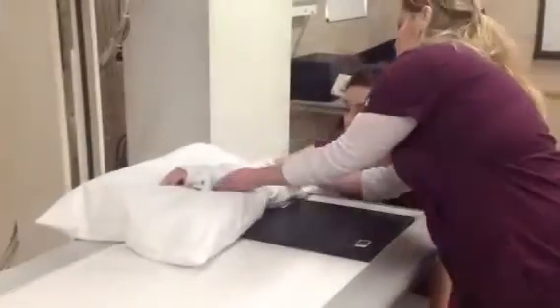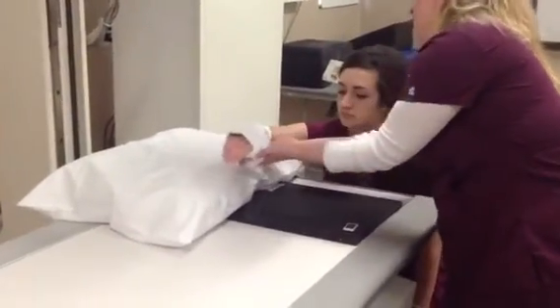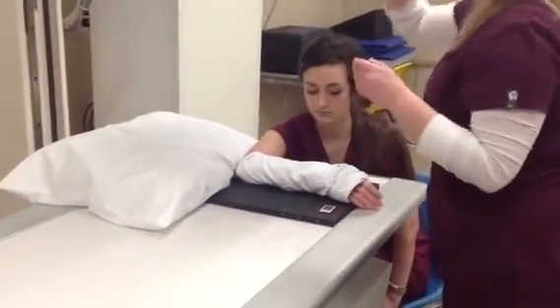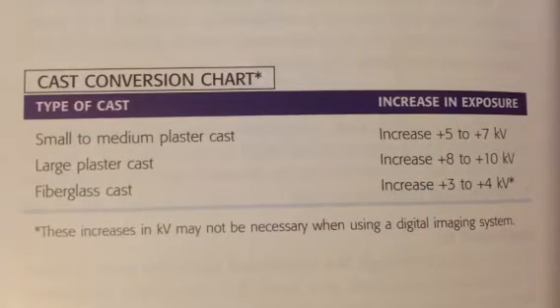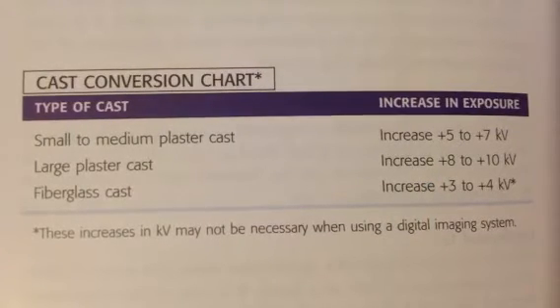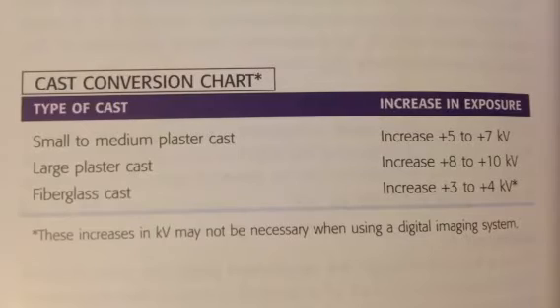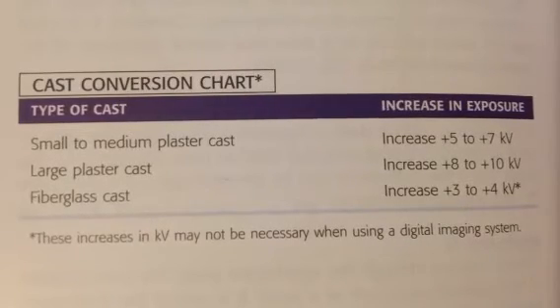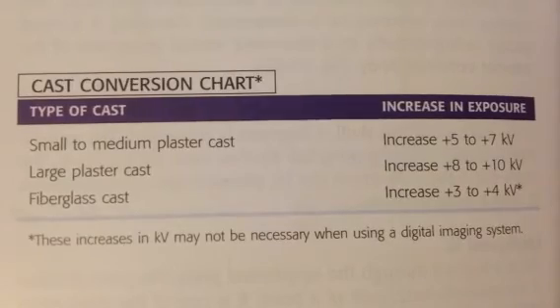Always remember your ALARA principles: as low as reasonably achievable. Apply proper collimation and centering to all of your exams. Something to keep in mind if you are performing an exam that involves a cast is that there are 2 different kinds of casts that are commonly used, and the kV range differs between them. This may not affect you if you are using a digital system.